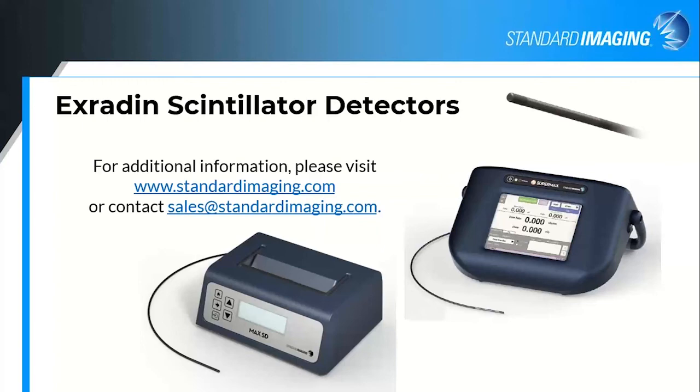I don't remember what people are doing right now. I do apologize. Is it easy to connect the W2 to a motorized tank? Yes, it's very easy to connect it. There's a triax cable that goes from the back of the Max SD to the input of your water tank. And from the point of view of the water tank, it looks just like a diode to your motorized water tank. You don't apply bias to it, but when the radiation is turned on, the water tank electrometer receives a current from it. So the Max SD does need to be about 1 meter away from the field if possible. The length of the W2 fibers is 4 meters long, so there should be enough slack for that to happen. And then the input goes directly to that input channel on your water tank.